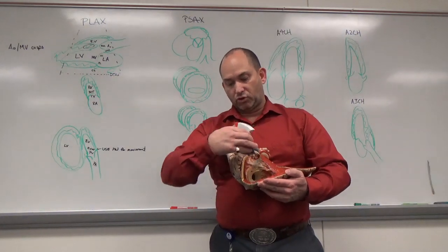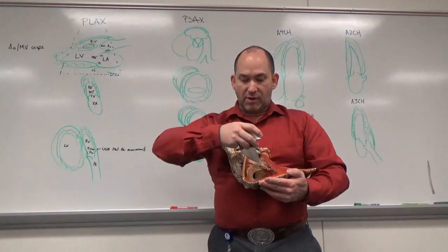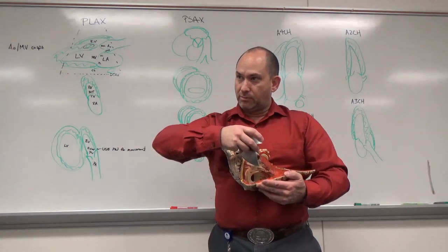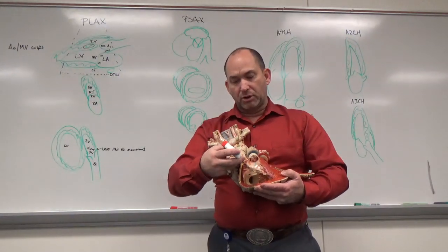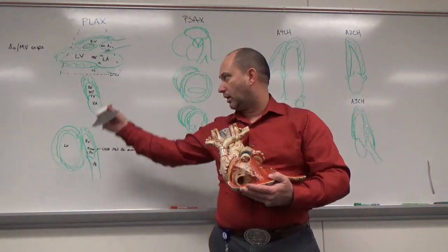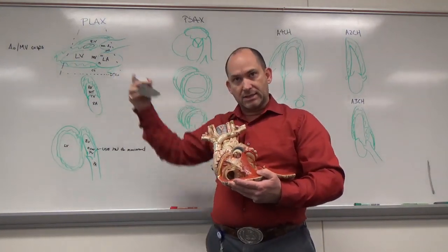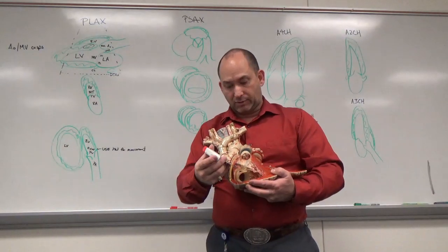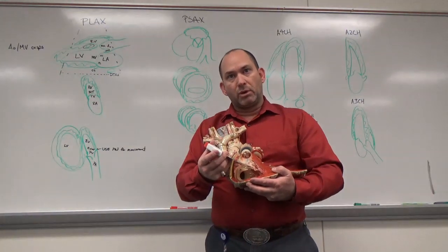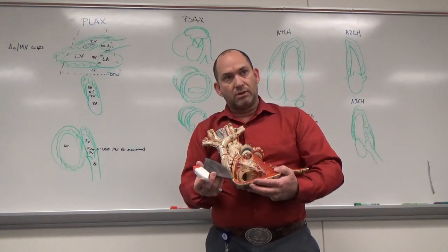Then we sweep to the tricuspid valve down. So if I want to see that valve, I go off of the aortic valve and point down that way. That's why we tip down that way. And then from here, this is kind of our reference for all these views. So if you lose yourself on these, go back to this, line it up so that it's maximum long axis, and then reevaluate where you're at. And we might need to jump up or down a rib space to be able to see those things.